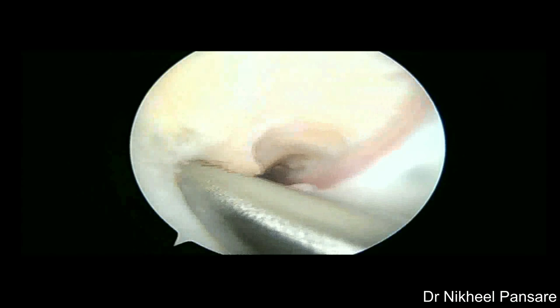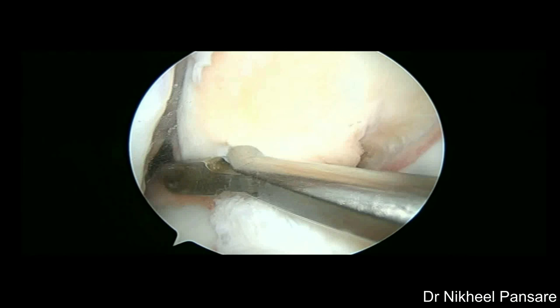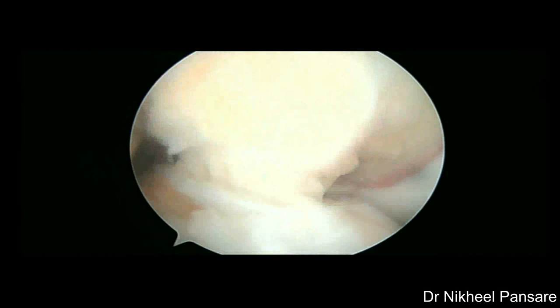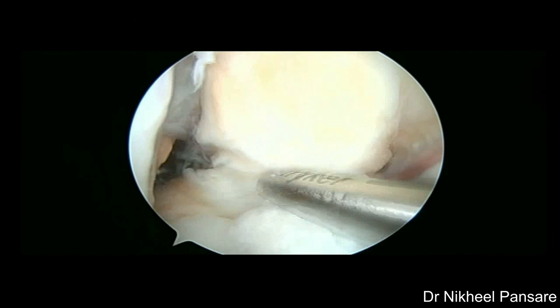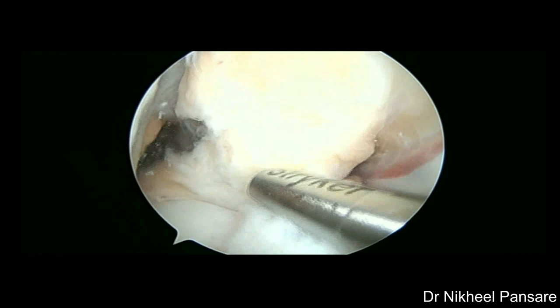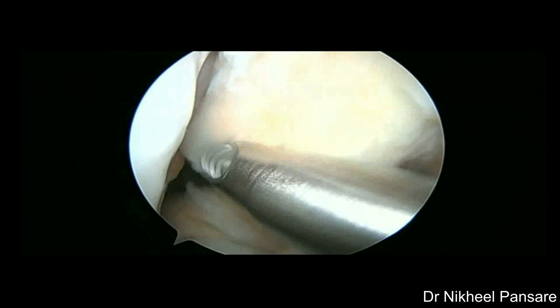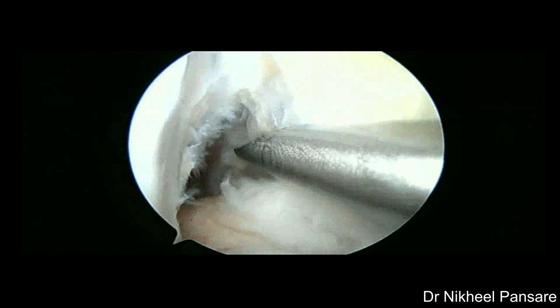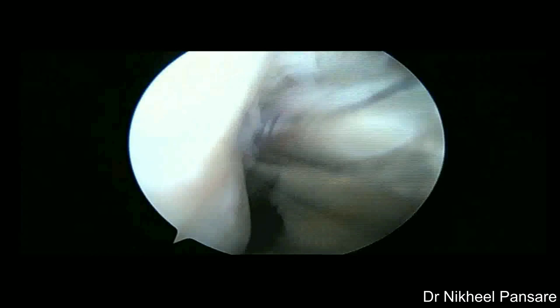Back to notch preparation. Some fibers of ACL are found to be added to PCL fat pad; these fibers are debrided carefully, taking care not to injure PCL. Always be careful about the posterior horn of lateral meniscus while preparing the notch with shaver. The posterior margin of lateral femoral condyle is exposed nicely. Superior part of the notch is also cleared of excessive tissue carefully to avoid graft impingement on extension.